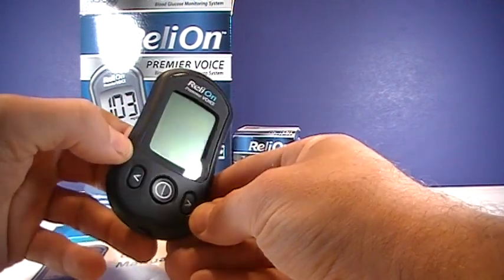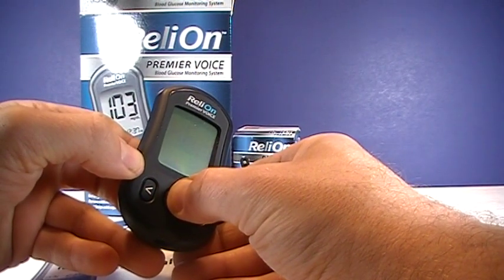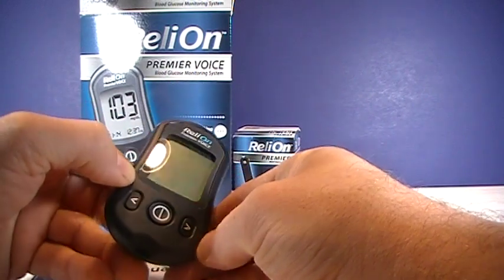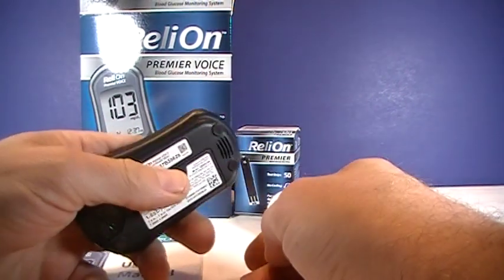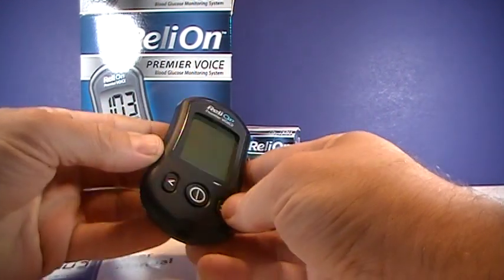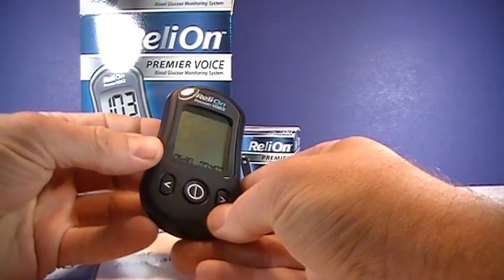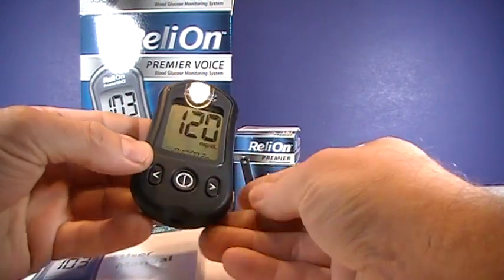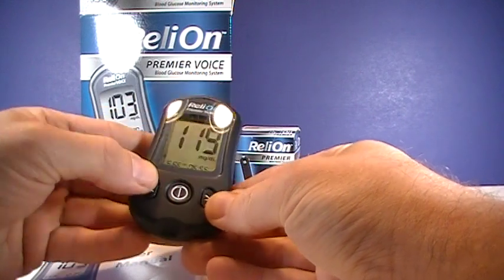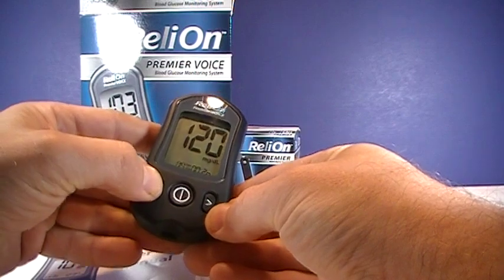Then it goes back to language selection, and once you're done, just hold the button. The set date and time will be confirmed — for example, May 30, 2019, 7:40 AM. Then your memory is right there. Press the right button to go through your readings, and press the left button to go through your averages.